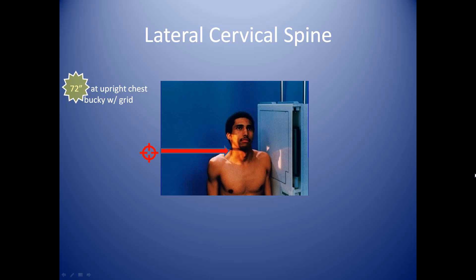For the lateral cervical spine, pull the camera back to 72 inches at the upright chest bucky with a grid. We pull back to 72 inches because of the distance between the tube and the patient's head — we can't avoid the shoulder being in the way. Pulling the camera in would create distorted angles that could be misleading, so 72 inches optimizes the anatomy to look appropriate. Center just above the adam's apple and below the chin, and include space just above the ears down to the tips of the shoulders.